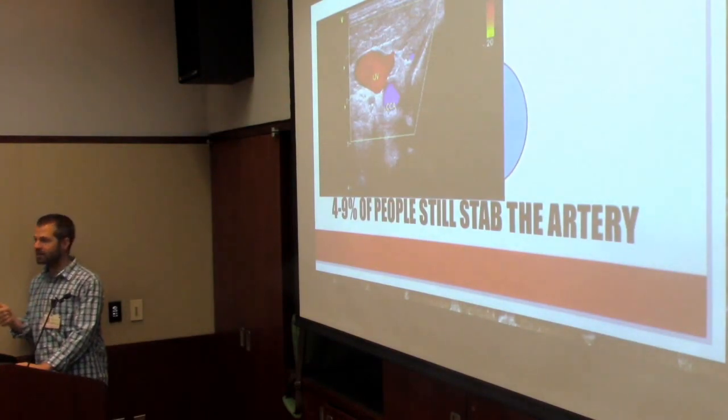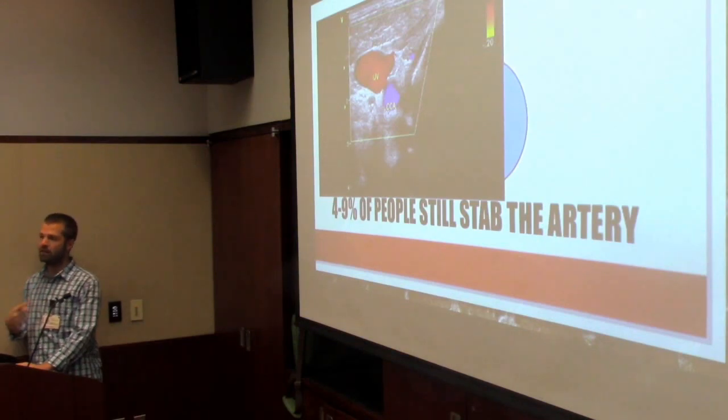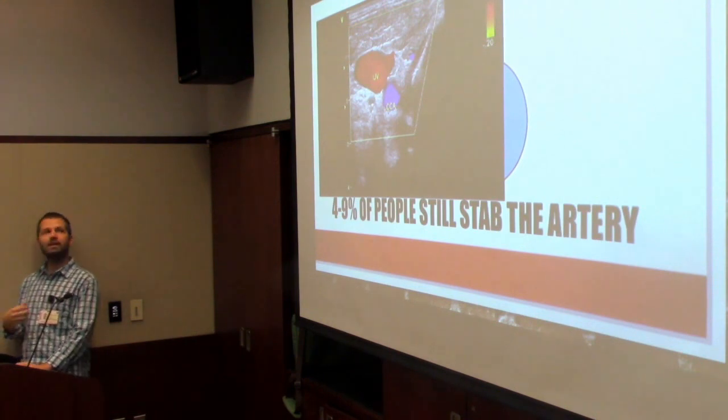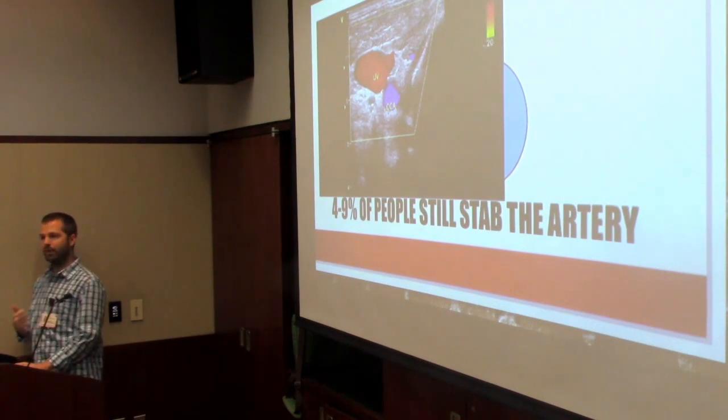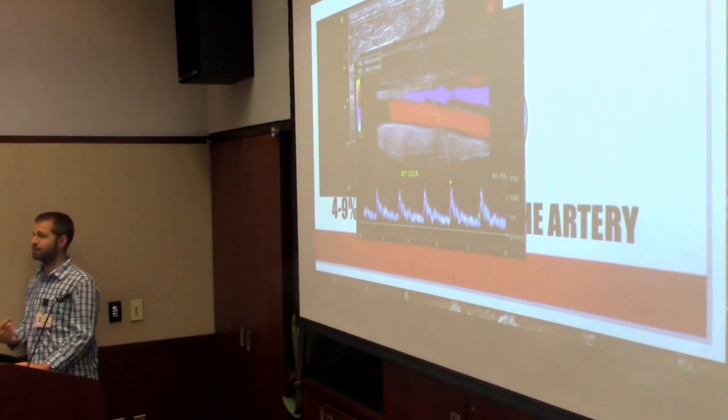So color doesn't matter, right? Because you can flip the probe and get the color in the other direction. Veins are usually a little bit larger in this part of the body. Anyone can tell me where we are? We're in the neck. It's usually a little bit larger when they're bearing down, when they have fluid in their body. It can be bigger. It can also be smaller. It's usually got a thinner wall, but there's a billion diseases that can change the thickness of your wall, or your ultrasound can be dropped 100 times and you can't tell the difference anyways because there's no resolution. So they're not absolutes. Some things are a bit closer to absolute.